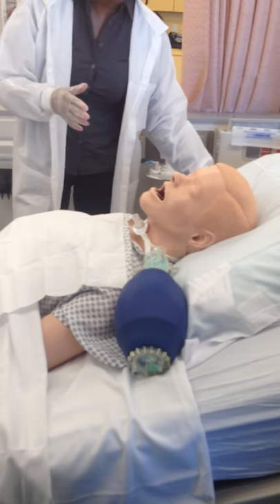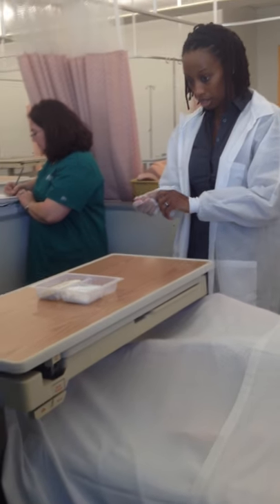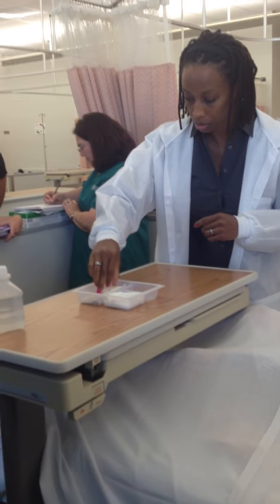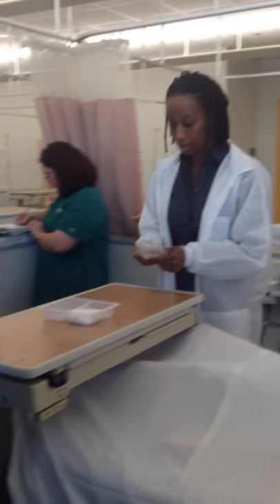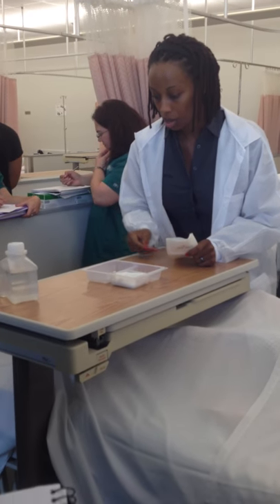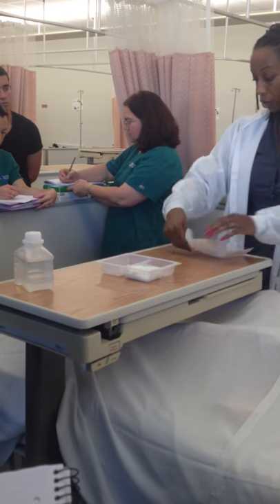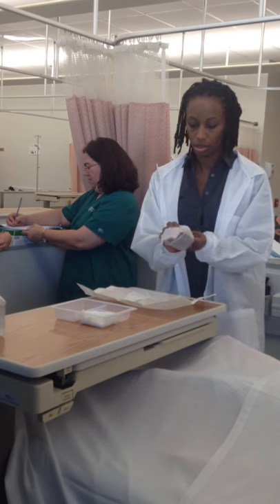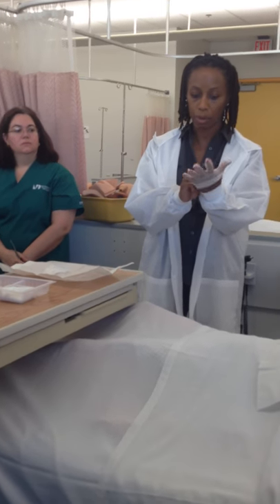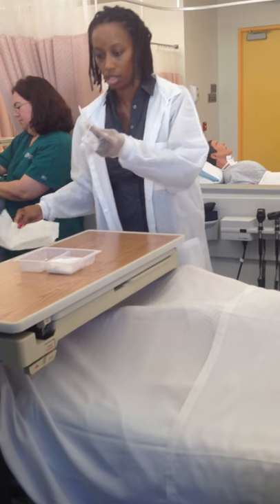The care part is more of a clean technique — you're done with the sterile part, but you still want to basically stay clean. Take these gloves off; now I'm ready for my clean kit. It's up to you if you want your helper to stay, because you don't have to pre-oxygenate anymore — they're able to breathe and shouldn't have any problems. Open this tray fresh, pour your saline into where you see the Q-tips. Your helper can leave and go back to their patient.